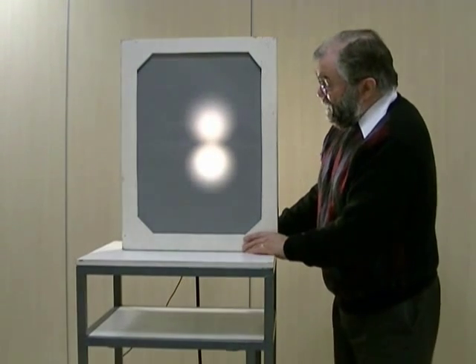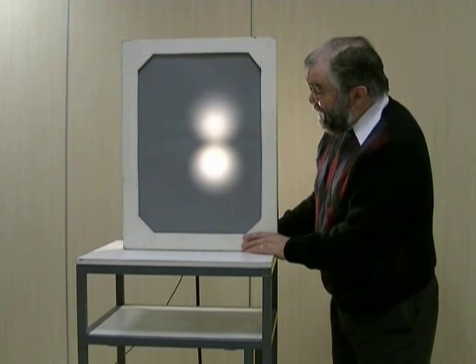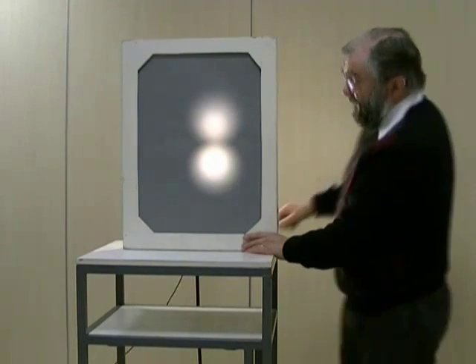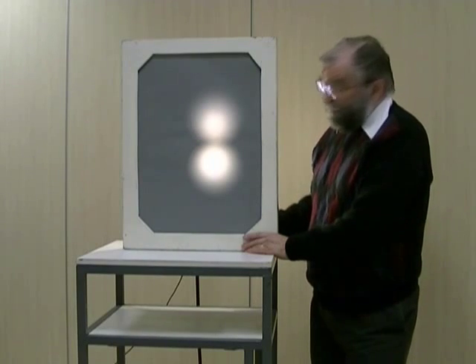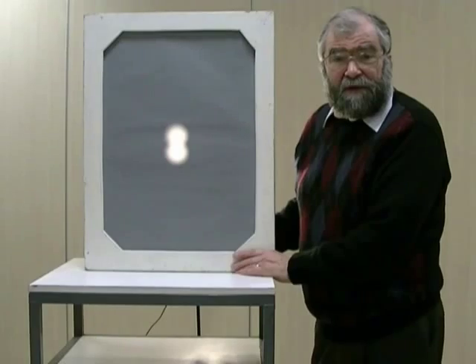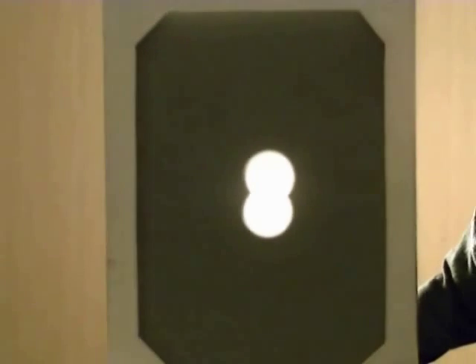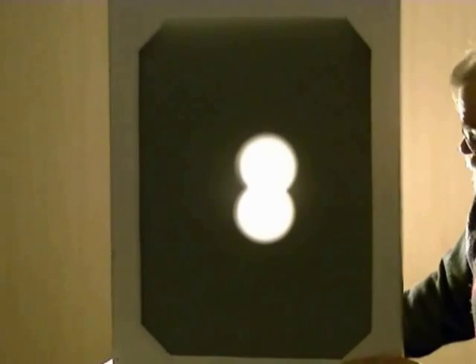The other thing we can look at is resolution — the ability to separate the images. When we're fairly close, we can clearly see that there are two separate images from our two separate sources. But as we come further away, the images get smaller and also merge into each other and become more blurred, so that we can no longer distinguish two separate images — it looks just like one large image. This is poor resolution. When we get close, we get better resolution and are able to separate the sources much more easily.